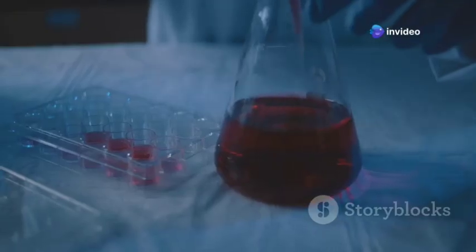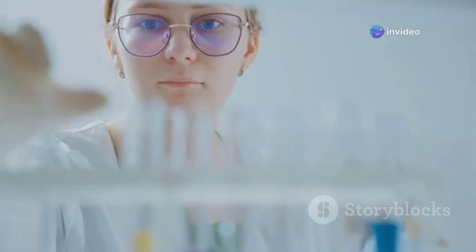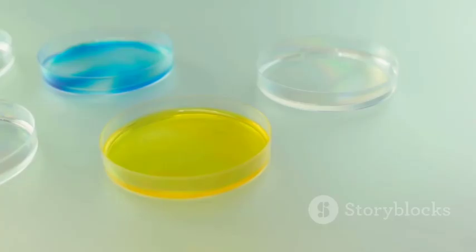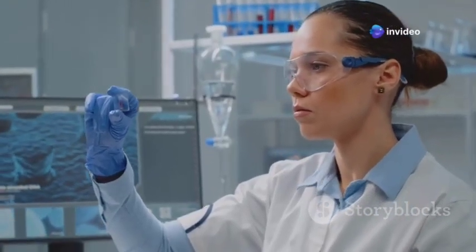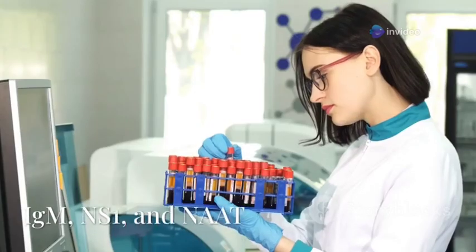When a blood sample is added to the ELISA plate, any antibodies present will bind to the antigens. This binding triggers a series of reactions that produce a color change. The intensity of the color change tells us how many antibodies are present. This helps doctors determine if someone has been infected with a particular virus or bacteria. Pretty neat, huh?